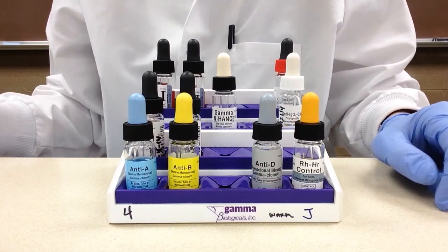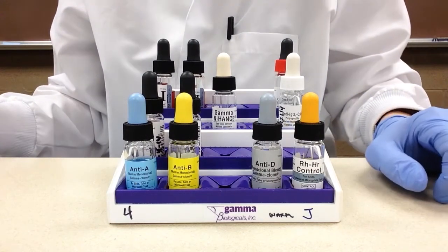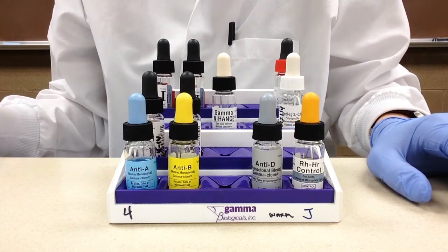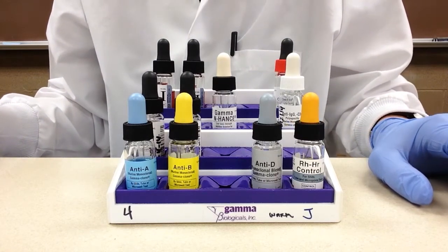The first rule is that the rack needs to be taken out of the refrigerator and the reagents need to be brought up to room temperature before they can be used. This usually is about a half hour.